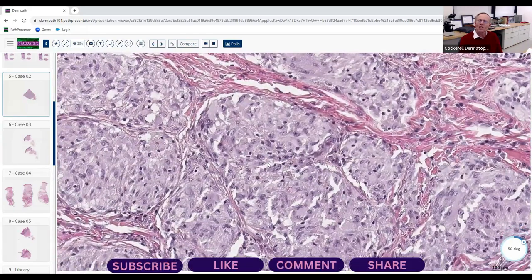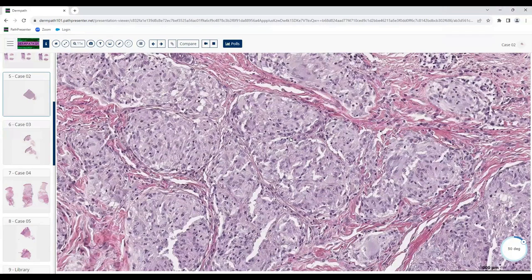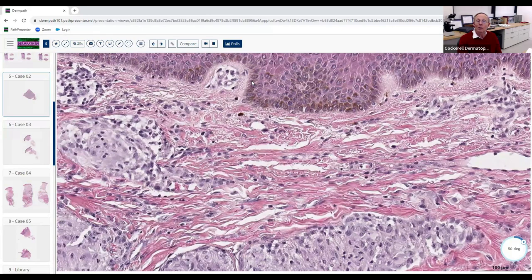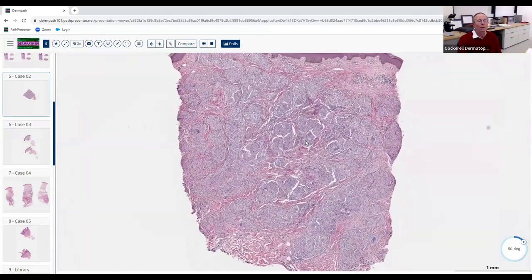Regarding special stains for fungi and AFB — what's the likelihood of a positive result with this much sarcoidal granulomatous inflammation? Very low — almost a waste of time. Even in patients with well-known obvious Hansen's disease with nerve involvement, anesthesia, and anhidrosis, you stain for organisms and you're not going to find them — you may need PCR. One last clue that we're dealing with real sarcoid: it's probably a dark-skinned African-American patient, where it's more common. Beautiful example of sarcoidosis.